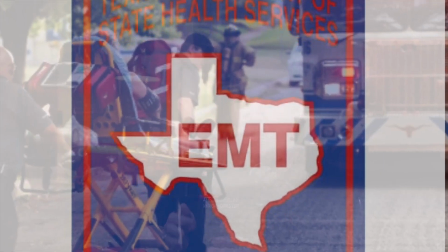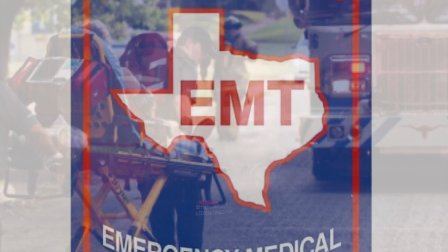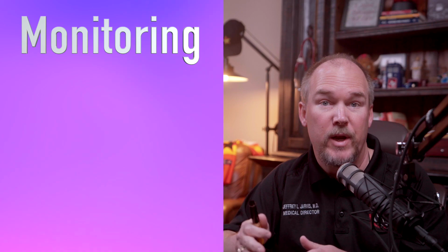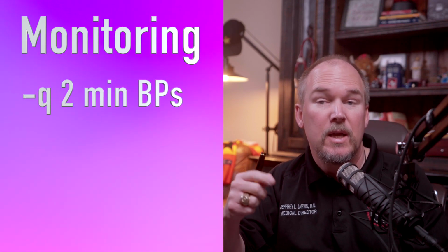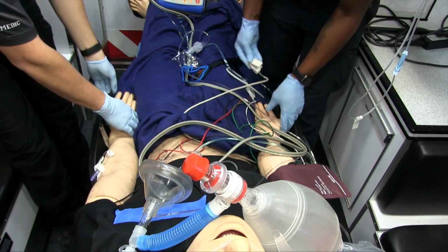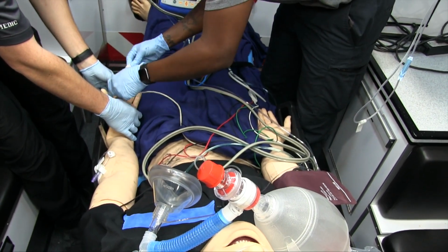So basics, preparation, it's similar to any invasive airway preparation. Ensure that appropriate monitoring, including every 2-minute blood pressure cycling, ECG, end-tidal CO2, and SpO2 is all in place. Make sure to place the pulse ox probe on the opposite arm from the blood pressure cuff, because as it is inflating, blood pressure cuffs cut off pulses downstream. And, as the name implies, pulses are sort of important for pulse oximetry, so let's make sure we continue to have them.